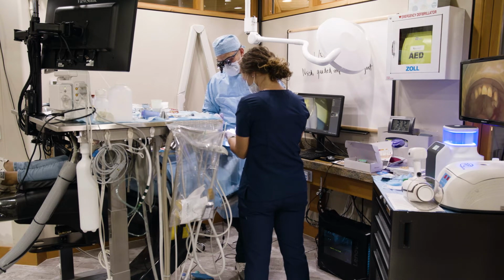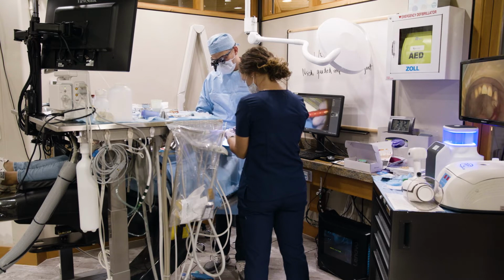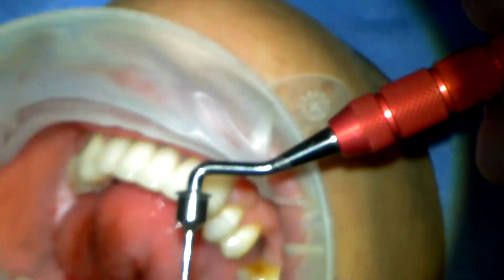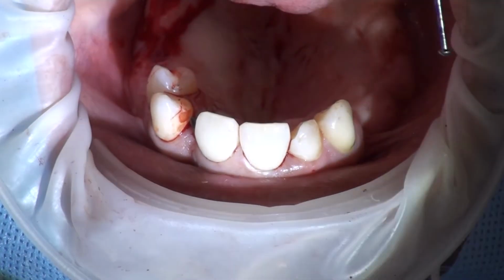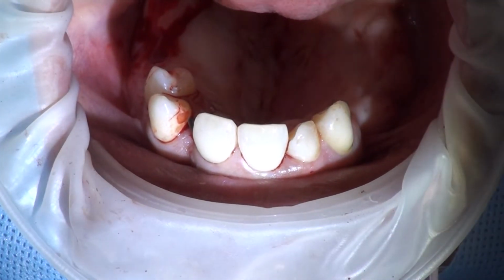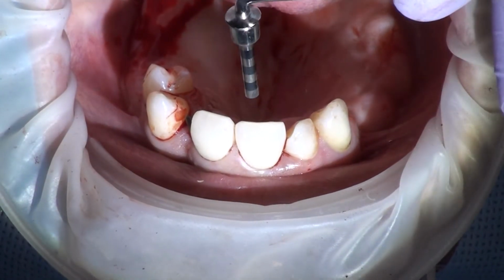So my bone of choice here, this is a beta tricalcium phosphate. It is mixed with the patient's plasma for a sticky bone application. I have 1/2 cc here. I'd like to use at least 60-70% of it. I think that's going to be just plenty. I'm going to go ahead and use my bone packer here. My H value is 9, and because the H value is 9, I'm going to use the 9 stopper on my bone packer.